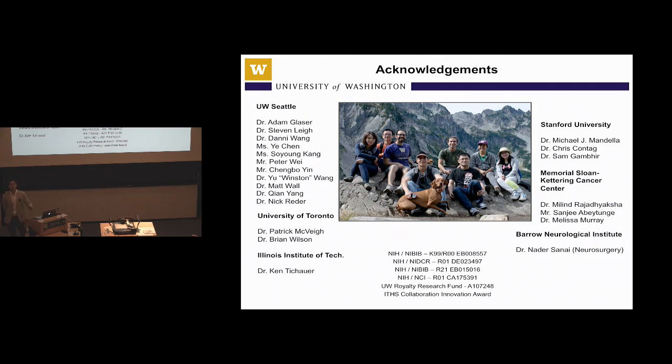So the endoscopy, the spiral scanning endoscope, is a low-resolution imaging. It's a wide area, but not microscopic imaging. The way we distinguish tumors from normal is based on their molecular expression pattern. To the extent that these ulcers or different conditions would or would not express certain biomarkers, we can distinguish them. But there is a spatial resolution limit. Right now, typically we scan at a 0.5 millimeter step size. So if it's just a few tumor cells, anything smaller than about 0.5 millimeter, we would be challenged to see.